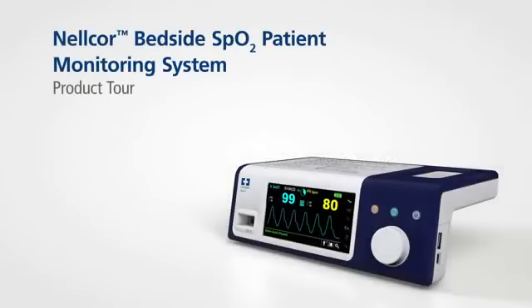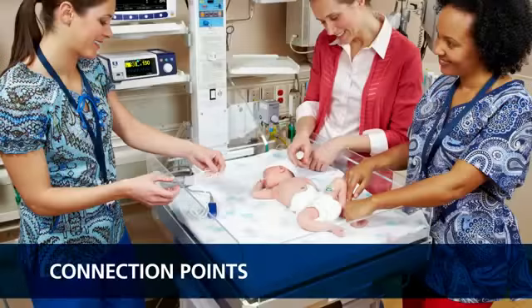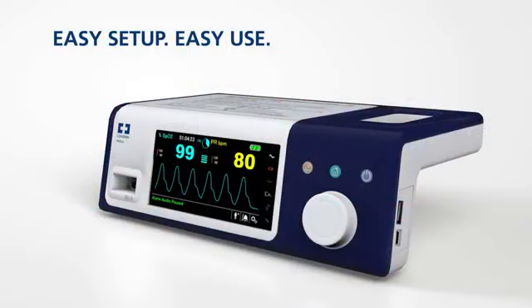The Nellcor Bedside SpO2 patient monitoring system provides clinicians with access to the most critical information regarding their patient's respiratory status. The Nellcor Bedside SpO2 patient monitoring system is designed for easy setup and easy use.